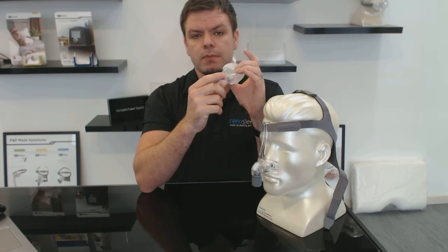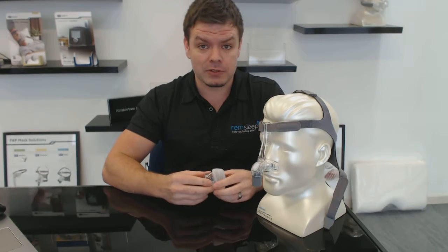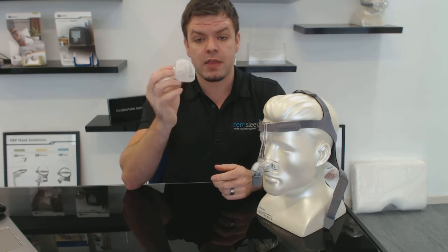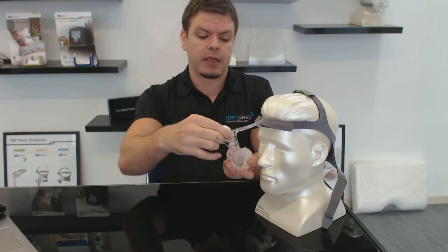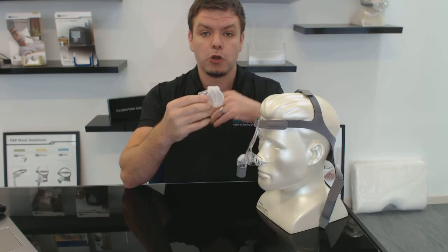It's also a really durable seal, which means you don't have to replace it as often and you don't have to spend as much money on parts. As those of you with CPAP equipment know, constantly buying parts does add up over time and can be quite expensive. Being a good durable seal that seals well is great, and it's also very easy to take on and off for cleaning — you just pull that part off, take it to the sink, give it a clean or a wipe with some CPAP wipes, and push it back in.